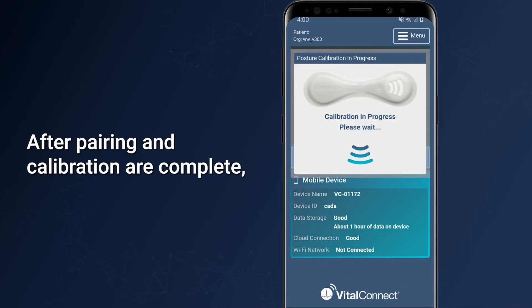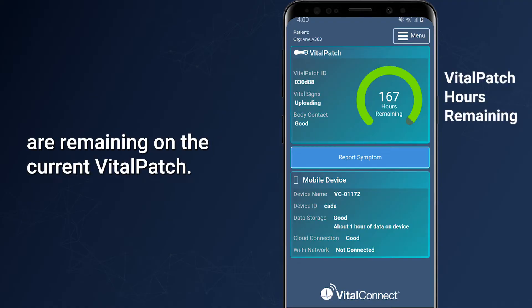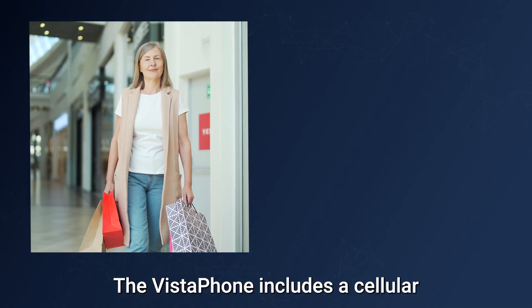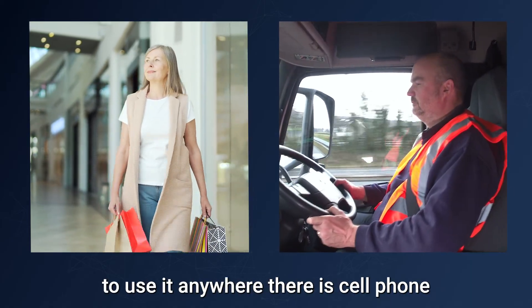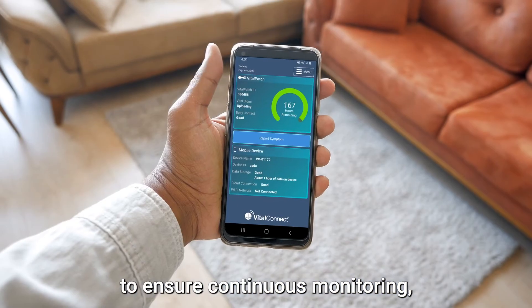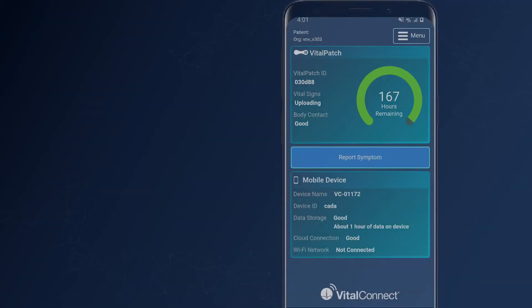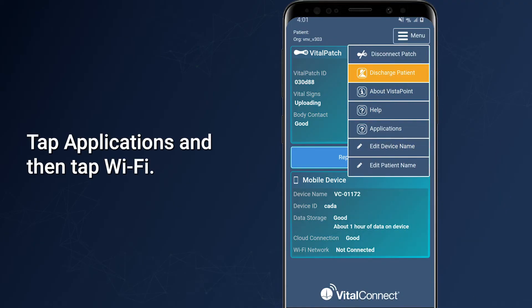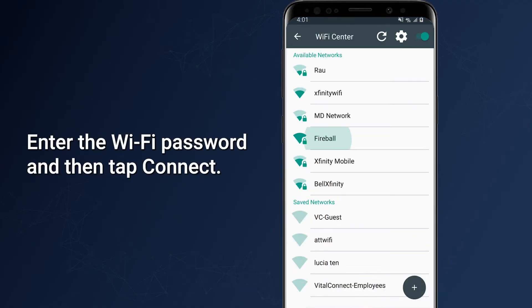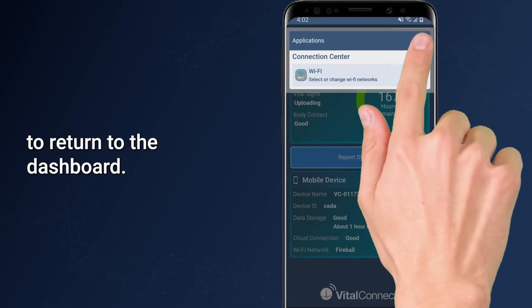After pairing and calibration are complete, the Vistaphone will display a dashboard showing how many hours are remaining on the current Vital Patch and information about the Vistaphone device. The Vistaphone includes a cellular data connection, allowing use anywhere there is cell phone coverage in the United States. However, for best results and continuous monitoring, Vital Connect recommends connecting to a Wi-Fi network when at home. Tap the Menu button, then Applications, then Wi-Fi. Select your network, enter the Wi-Fi password, tap Connect, then tap the back arrow to return to the dashboard.